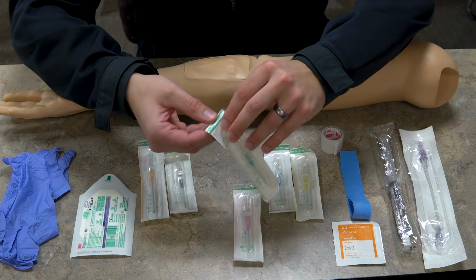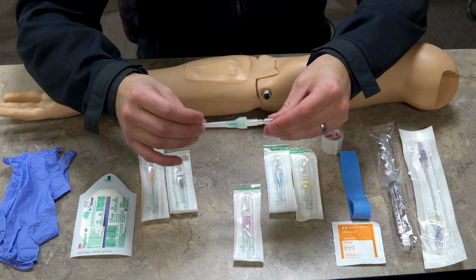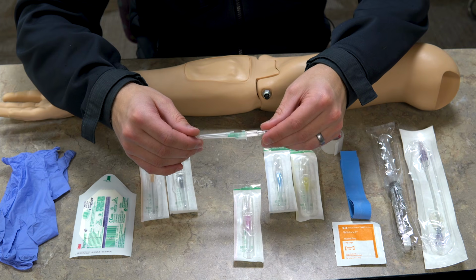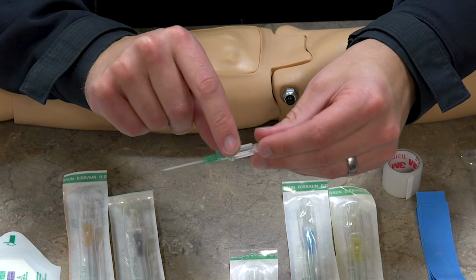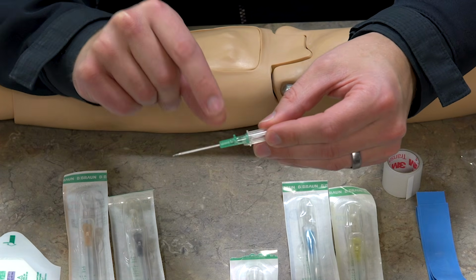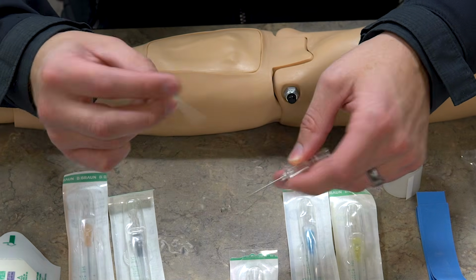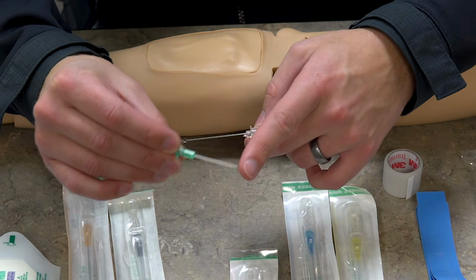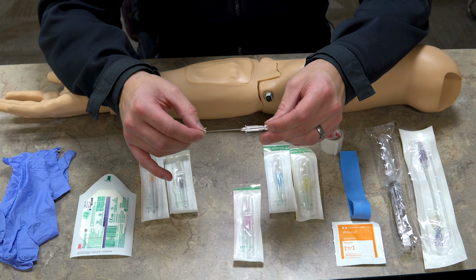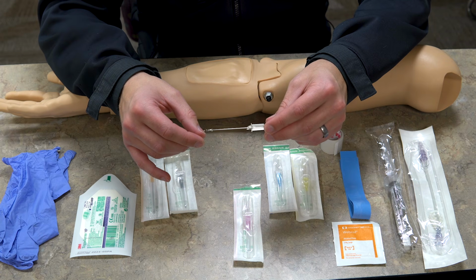So we're going to open one of these up and I'll show you what's involved in these catheters and how they work. So you're going to open it, and there's a lot of different brands. These are just what we use. They all have some kind of safety device in them for when you take the catheter out. Now back here, this is the flash chamber. You have the catheter here that will actually slide off the needle, and then the needle underneath that. When you actually start this IV, you're going to push this into the patient, and they're only going to have this plastic tube. Now you notice when I pulled it out, this has a safety cap on. Most IV catheters will have some kind of safety device that's utilized to protect the person from stabbing themselves or something like that.